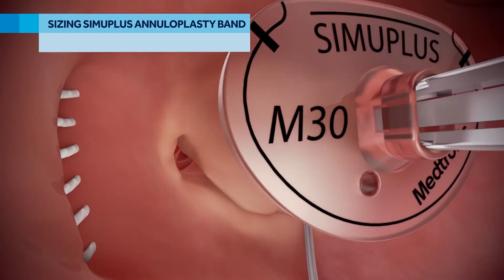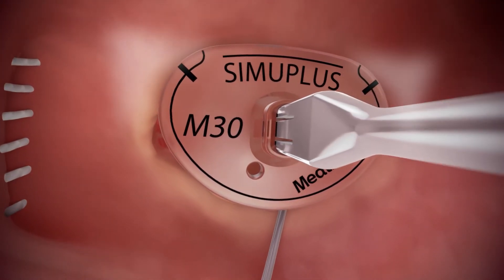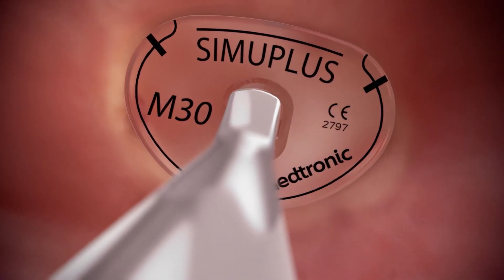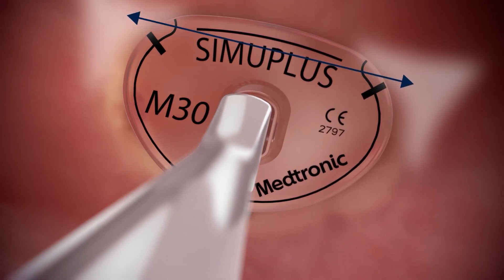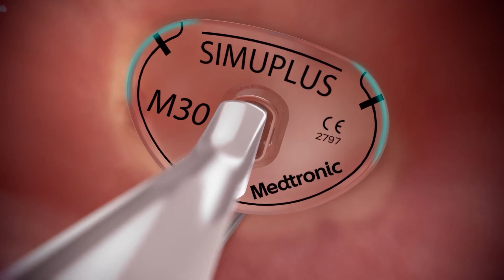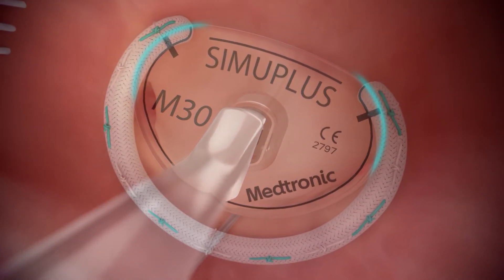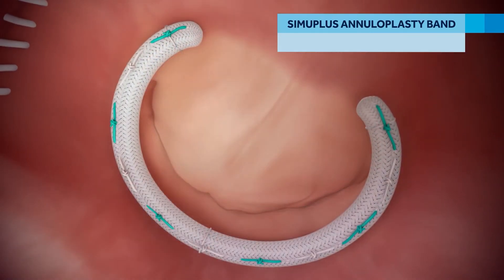To determine the proper SimuPlus flexible annuloplasty band size to implant, lower the sizer onto the valve annulus and align the trigone markers on the sizer with the trigones. Determine the appropriate mitral band size by locating the sizer with a trigone marker spacing that best corresponds to the intertrigonal distance. The outer edge of the sizer shows where the implanted band will sit on the valve annulus. SimuPlus bands are length and size to the trigones.